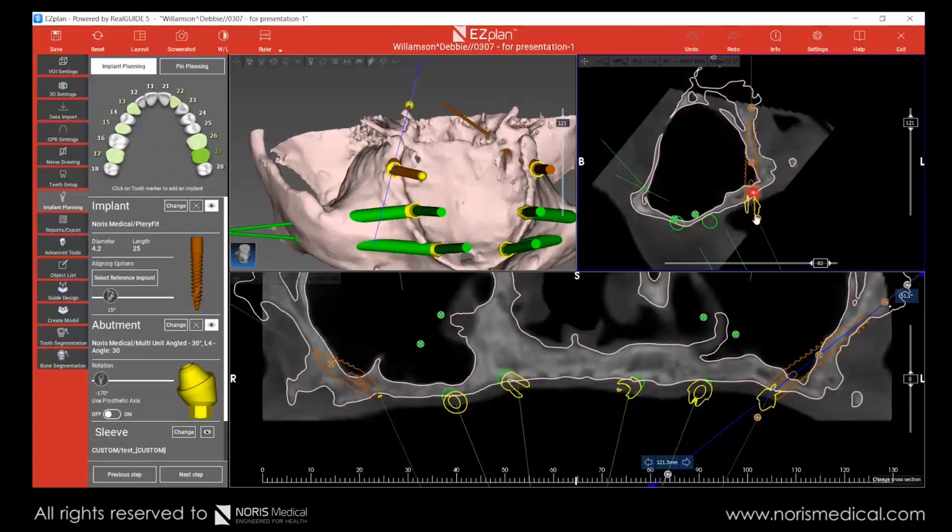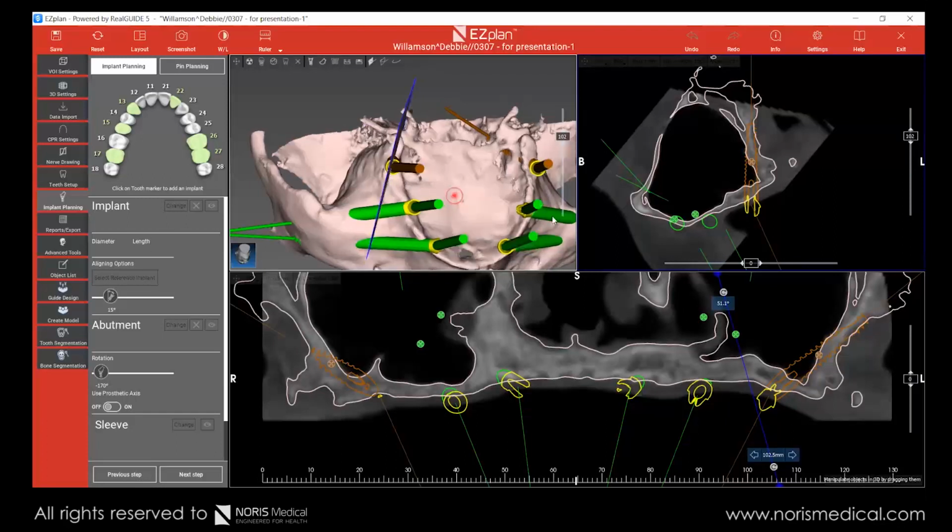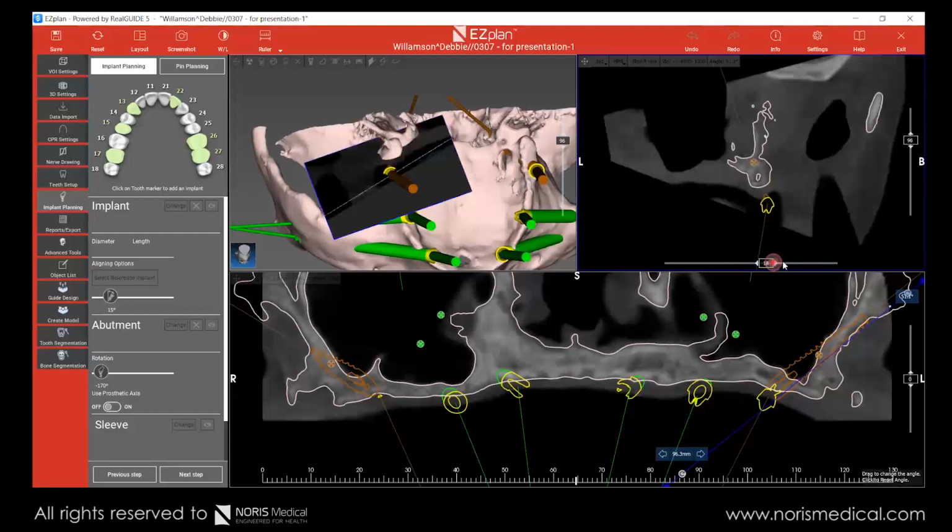So if we use an osteotome and mark this point, it will prevent the drill from slipping, and we will be able to manage that. Otherwise, we might find ourselves falling inside. If we don't take care, we might lose the implant. In this case, it can just fall into the sinus. Okay, so this is the angle taking us towards the medial plate.